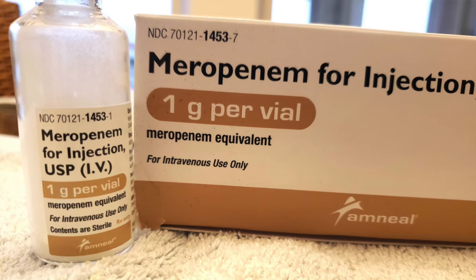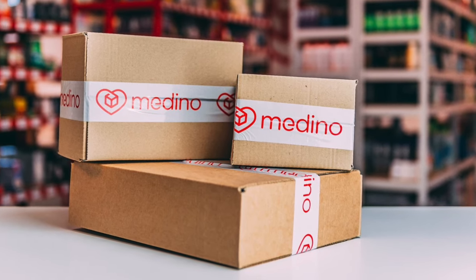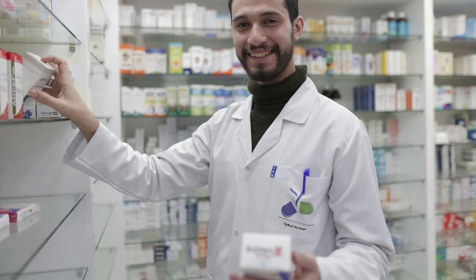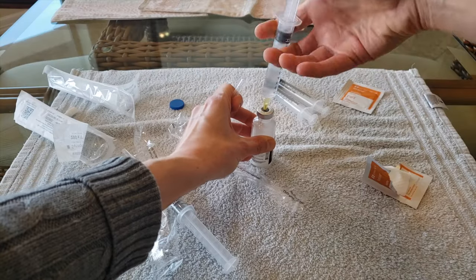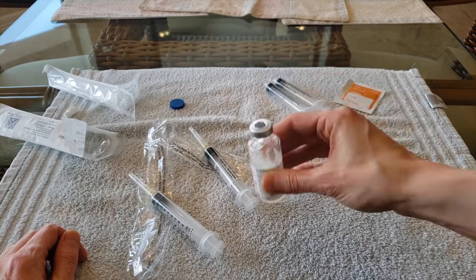The IV medicine I use is called meropenem. It can be ordered from a regular pharmacy such as CVS or Walgreens. My doctor submits the prescription to the pharmacy, which orders the medicine, and in about one day I have the vials of powdered medicine. In order to use the medicine, I have to mix the powder with either sterile water or saline. I currently have pneumonia and need to use meropenem to get rid of my infection.